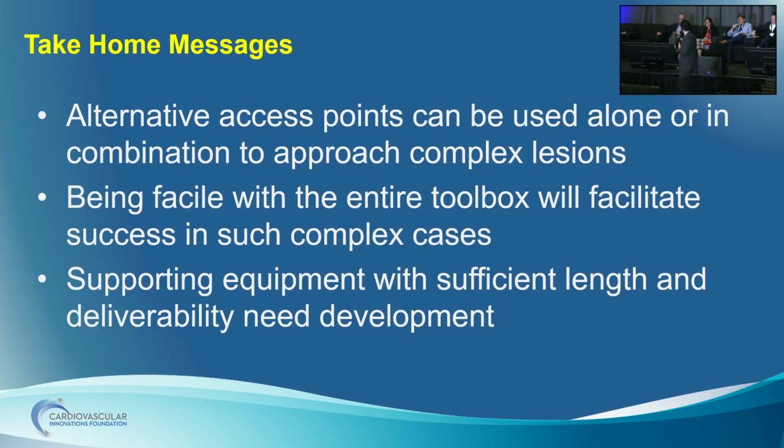Sanjum, can I ask you a question here? On that Supera stent, the ostium, it's a great stent. You usually can't get it. Did you deploy that from your retrograde access? Because you had to, really, to nail that ostium, right? Yeah, that's exactly correct.